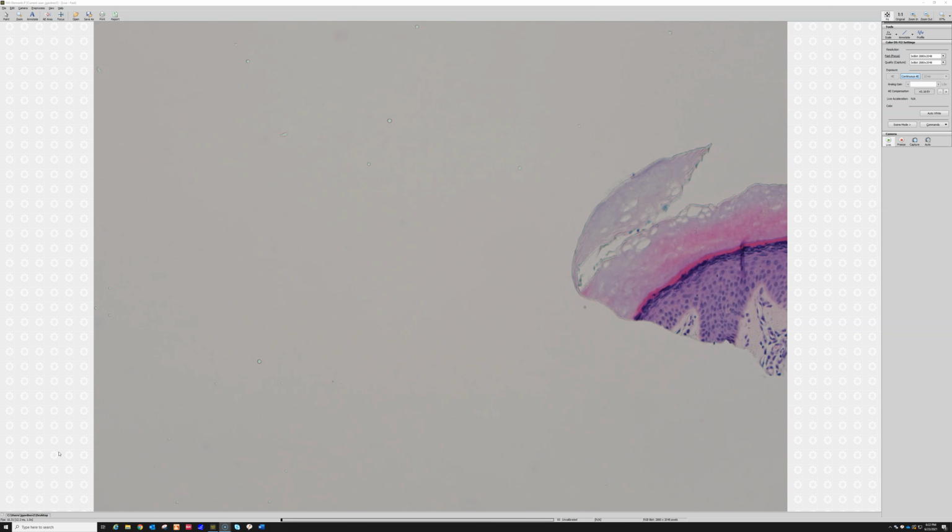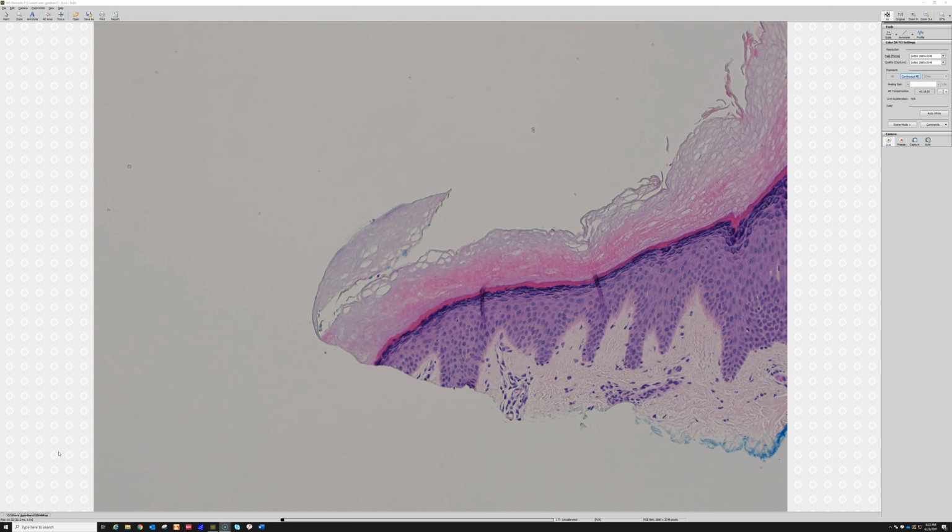Also, again, if you haven't seen the skin histology video, you can check it out. But look at this little pink line here. Anyone know what that is? I can't hear your answer, but hopefully some of you are saying stratum lucidum. Well, lucidum makes you think it's pale or clear, but it's actually not. Usually stratum lucidum, to my eye, looks pink, at least on the H&E stains that I've seen.